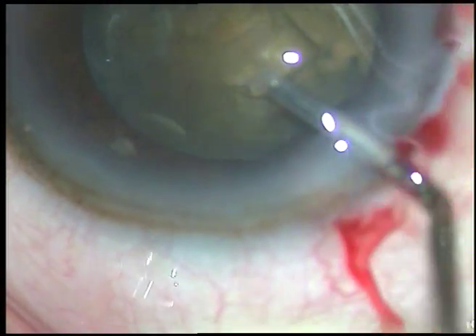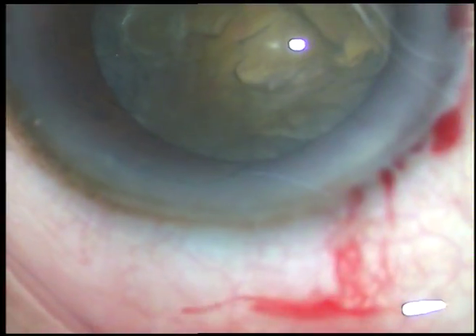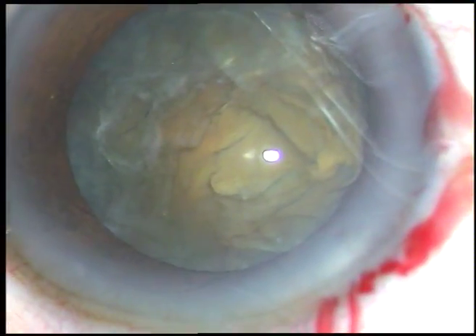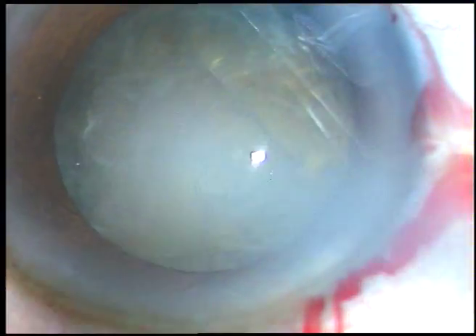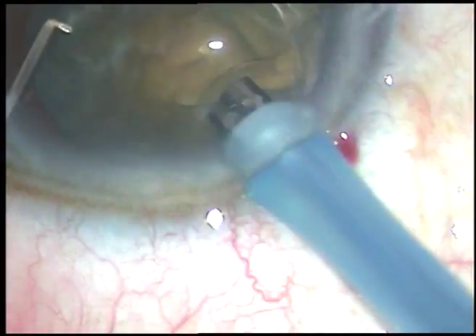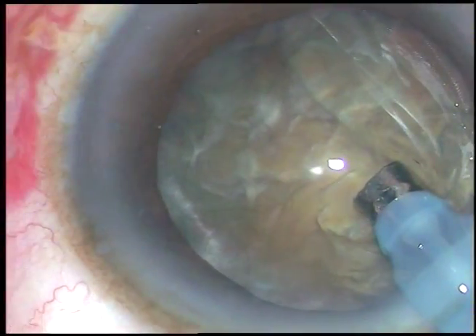Viscoelastic substance — hydroxypropylmethylcellulose 2% — is again injected, and now it is time to introduce the tip of the phaco handpiece into the anterior chamber. And here goes the tip. This is the Oertli Cataris 3 phaco machine.